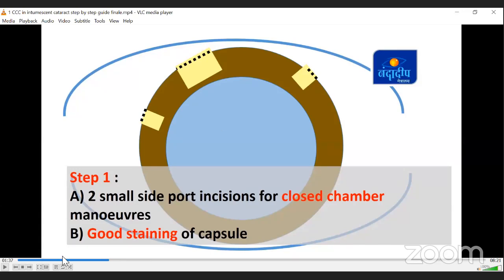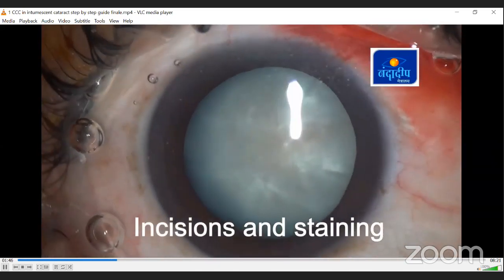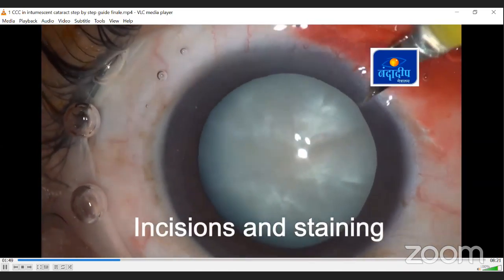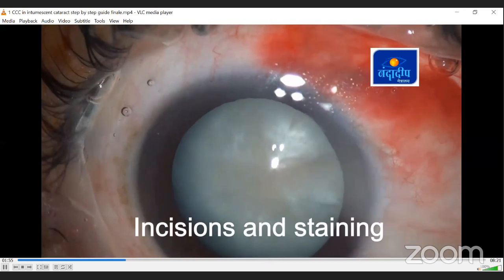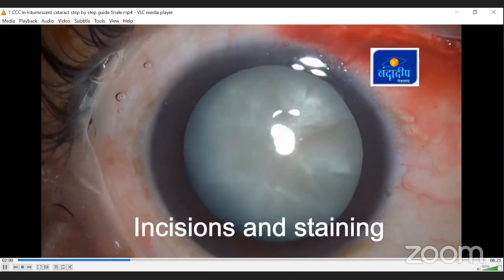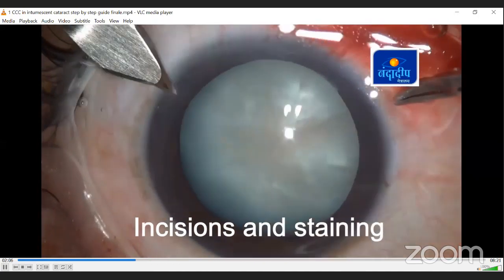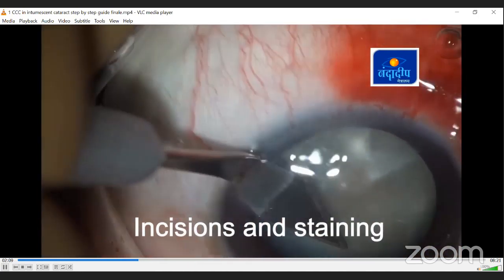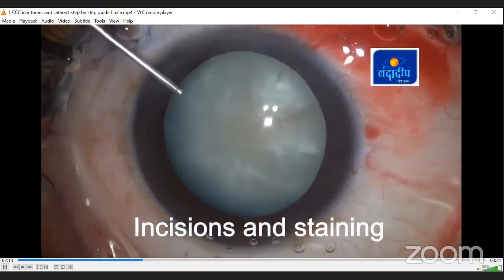So let's start with step 1, where I'm going to make two very small side port incisions, because that is going to help me in maintaining the anterior chamber much better. If I use the large main incision, yes, I may be able to do CCC in few cases, but not in all, because there is always a chance of visco leak from a larger incision. This chance is less from the small side port incision. So the first part is making the side port incisions, making the main incision, and then staining of the anterior capsule.